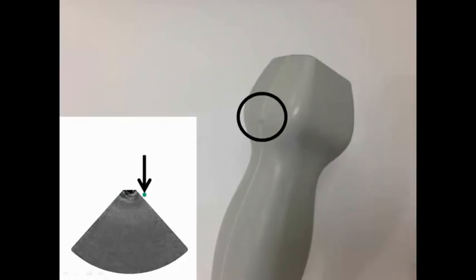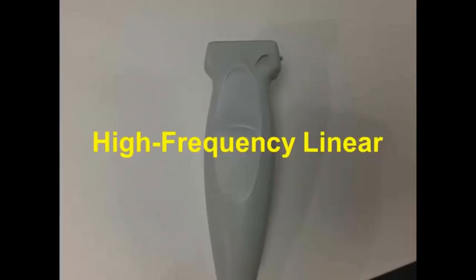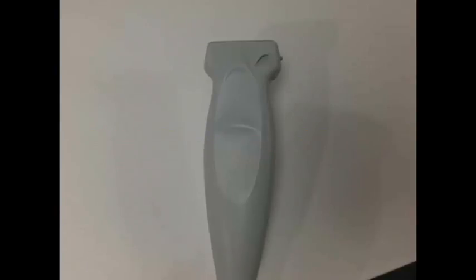Be sure to double-check the location of the screen and probe indicators if you ever feel like the image orientation isn't making sense. This is the high-frequency linear probe. You may hear this probe referred to as the vascular probe. The name comes from the frequency of waves it is engineered to emit, in this case high frequency, and the footprint of the probe, which in this case is flat, or linear.